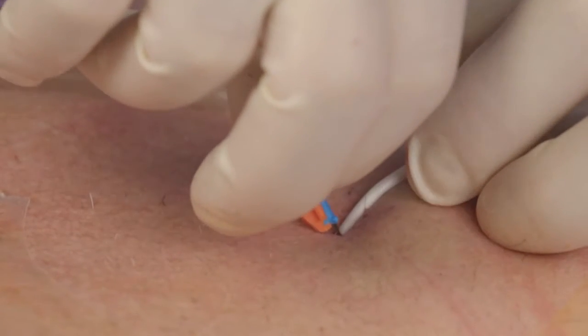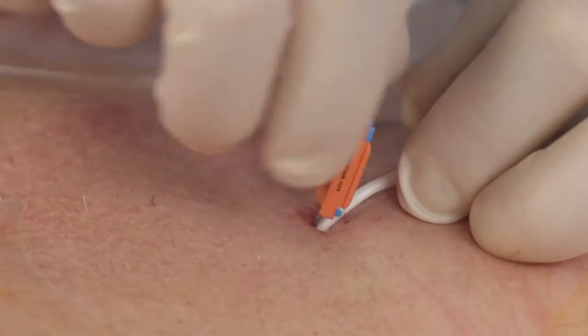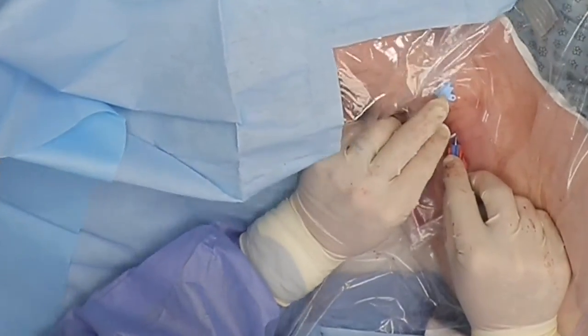Release the SecuraCath base, allowing it to fully open until flat. By orienting SecuraCath towards the clavicle, it will allow for easier management of the lumens while in situ. The base should lay stable and flat without movement.